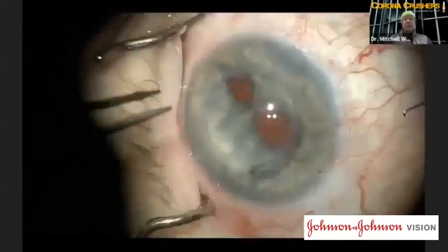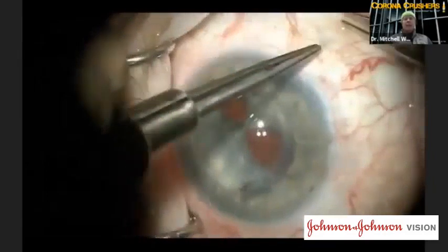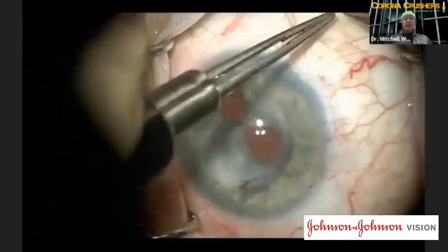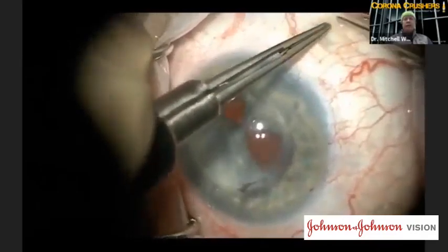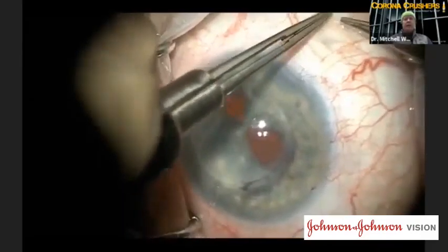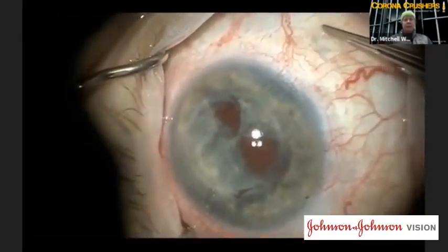So instead of trying to twist and wind around forceps, we're just going to take the end of this and pass it under and over and under and over 4 times. Sometimes that's a little bit easier as well. And again, I like to stay on the side of the loop that is the same as the long end of the suture that goes all the way across to the other side.